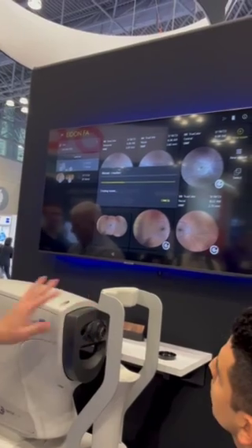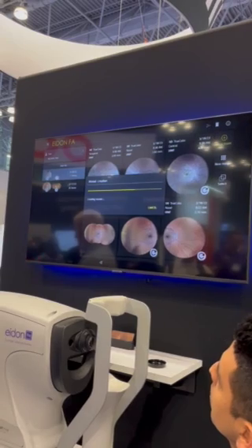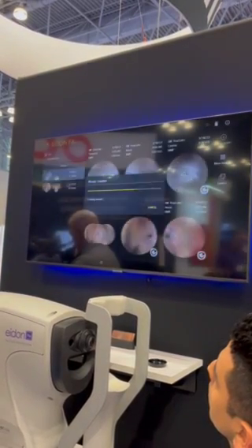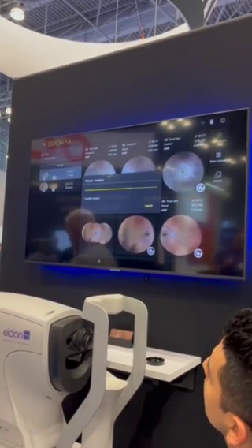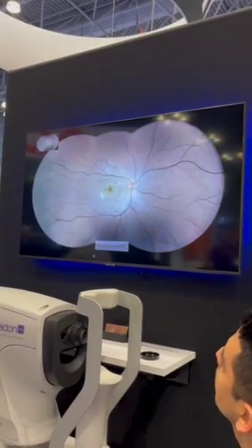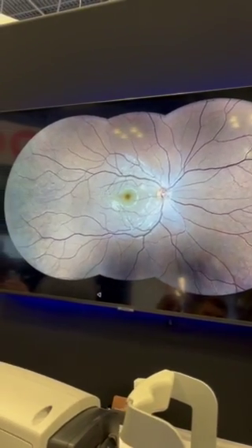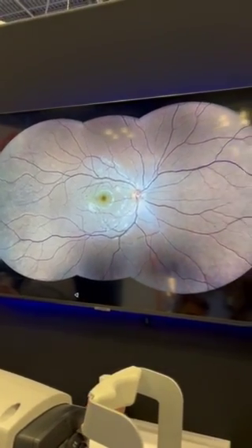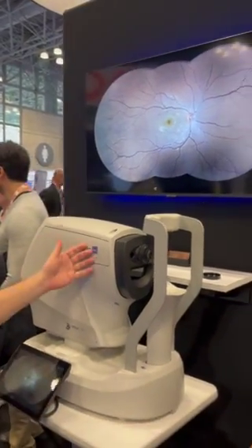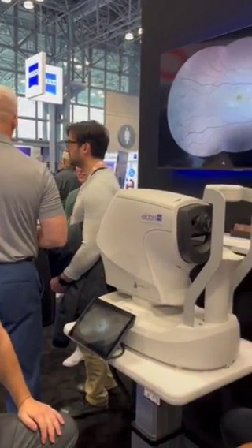And that's going to give us a 200 degree ultra wide field image, thanks to our new ultra wide field lens that allows us to get out that far. It takes about 10 seconds — and there we go. 200 degrees with the image quality and clarity you're not going to see anywhere else. The reason for that is we use a white LED light, as opposed to other systems that use lasers, and the system is also confocal, which gives us that beautiful, high quality image.